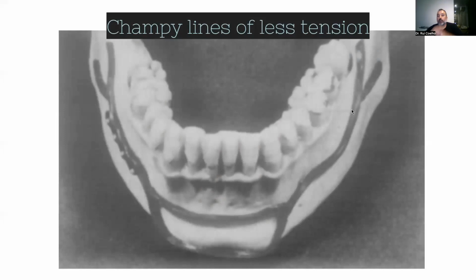What you are going to see over this new type of implants is this same design. And this design is what works every day in every hospital. Every time that someone arrives with a fracture, it's these points that we use to put the plates, because after this paper we did not have the need to use bicortical screws with the plates on the border.